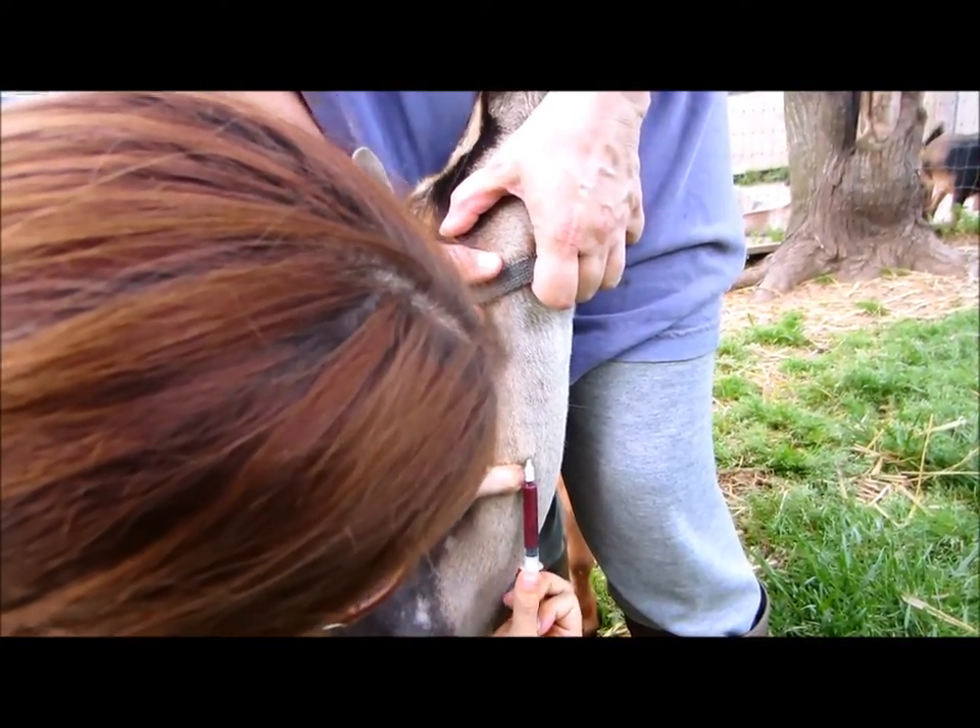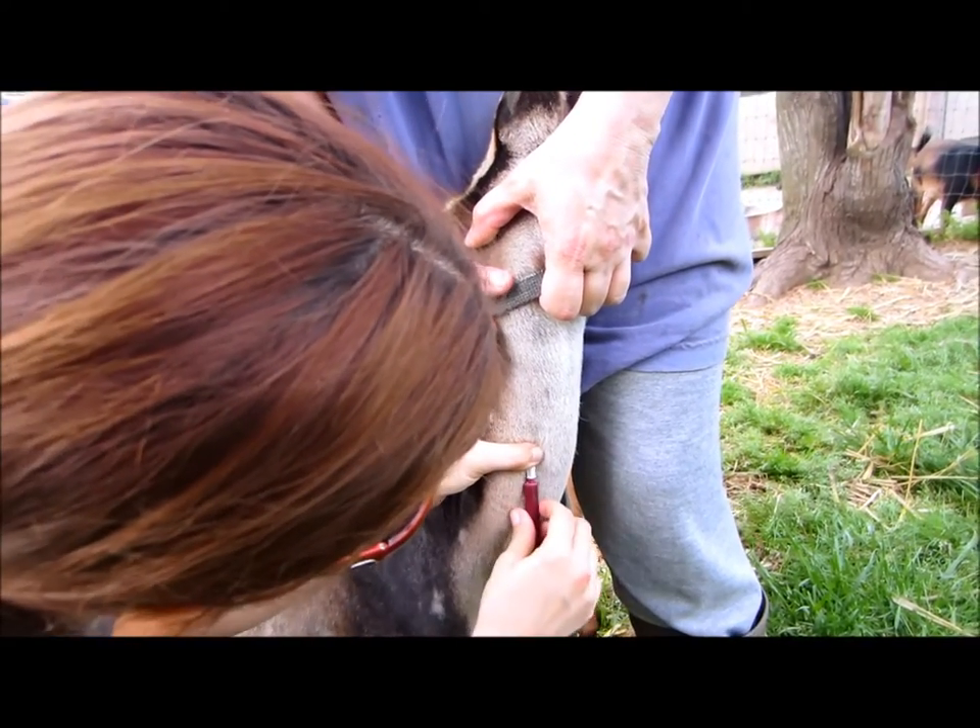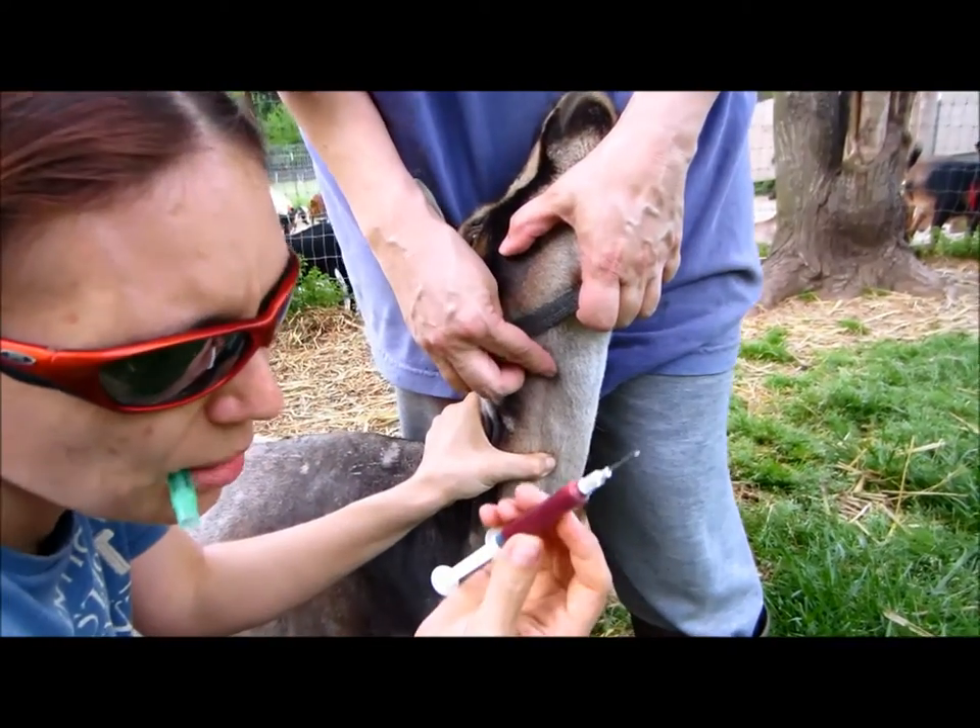And there we go — it's as easy as that. Put a little pressure on it and there you go. You have blood.